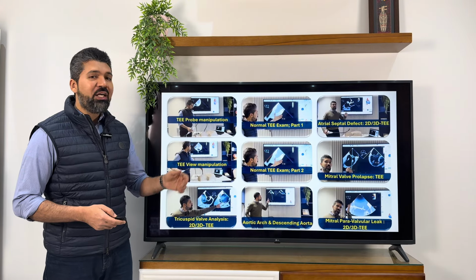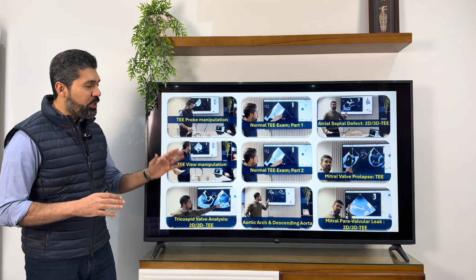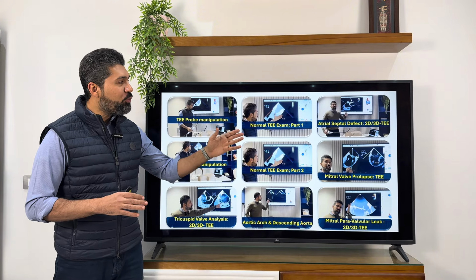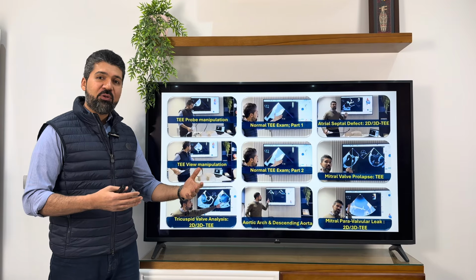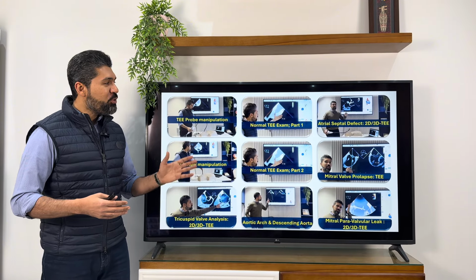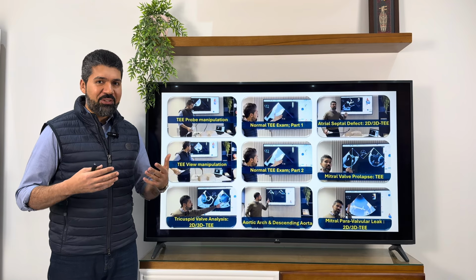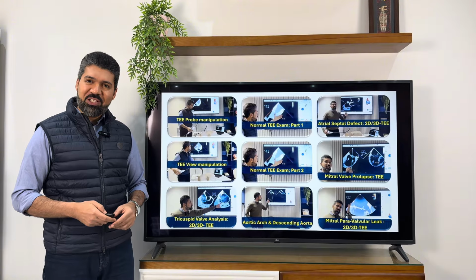We have 9 lectures explaining, on a TE simulator, how to manipulate the transesophageal probe, how to control the image, how to do the normal transesophageal echo exam, and then we'll go on to pathologies of the tricuspid valve, mitral valve prolapse, para-valvular leak, aortic root aneurysm, and so on. So this course covers most of the practically important topics in transesophageal echocardiography based on TE simulation.